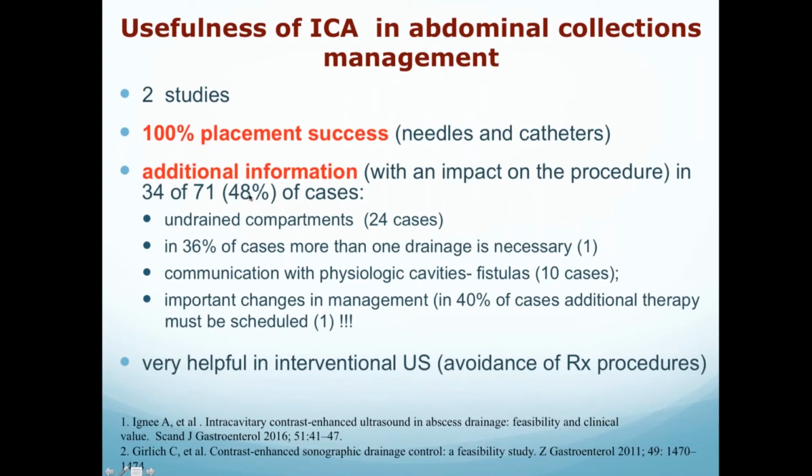So there are some studies, only two studies, which demonstrate a good placement success and additional information obtained through this technique in 35 to 50 percent of cases, and it is very helpful in interventional ultrasound because we can avoid further procedures.